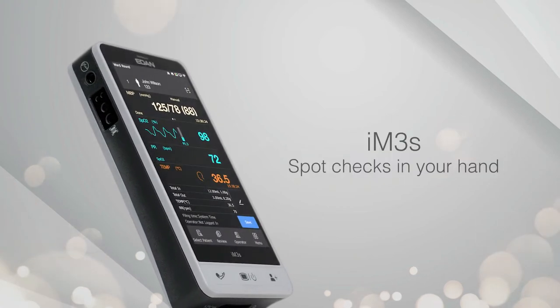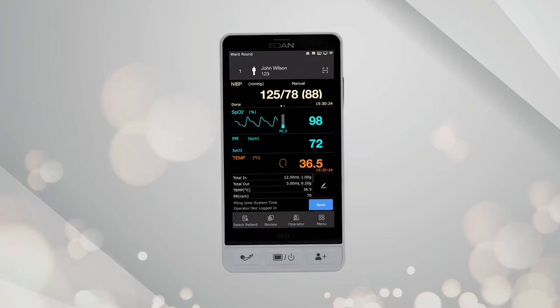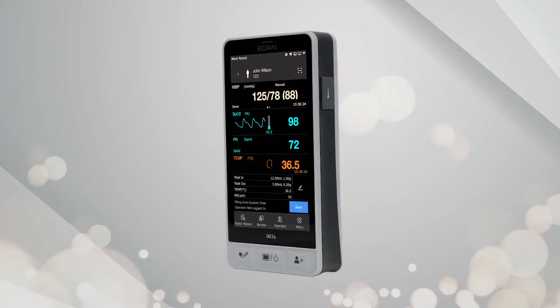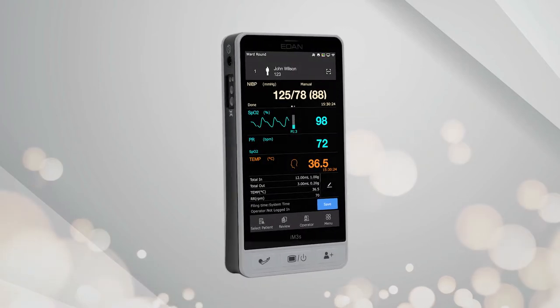Spot checks in your hand. Eden's IM3S is a palm-sized vital signs monitor that integrates SpO2, blood pressure, and pulse rate marrying together. The compact design of the IM3S makes it a perfect solution for mobile terminal vital spot checks.